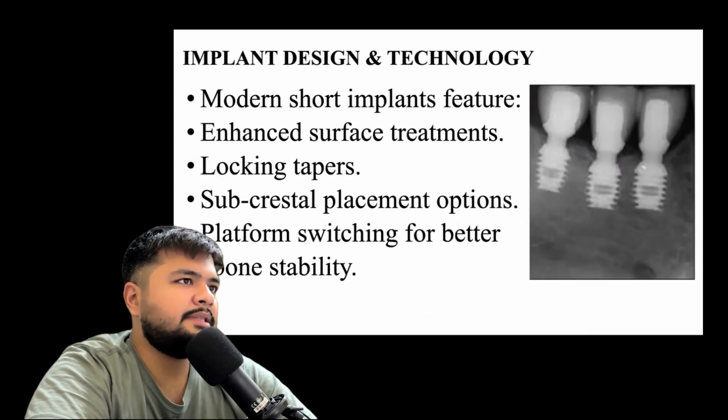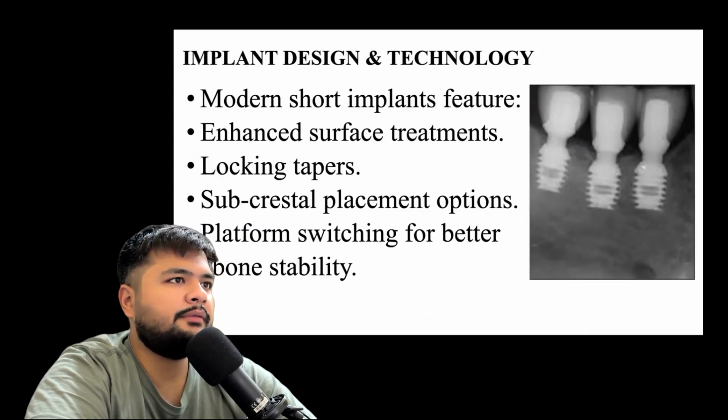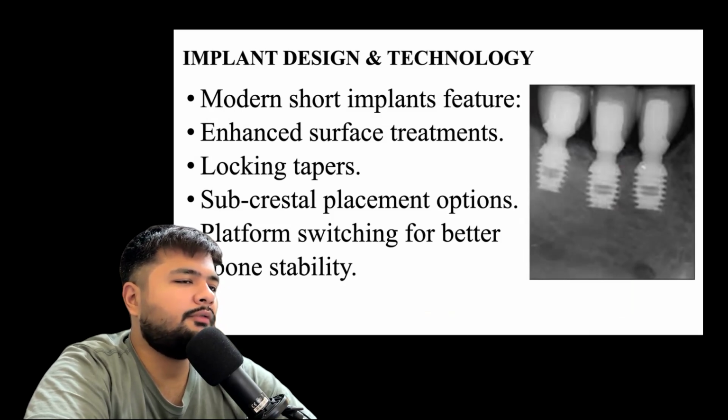Then, coming to implant design and technology, modern short implants feature enhanced surface treatments, locking tapers, subcrestal placement options, and platform switching for better bone stability. So, what is platform switching? You might be thinking of that.